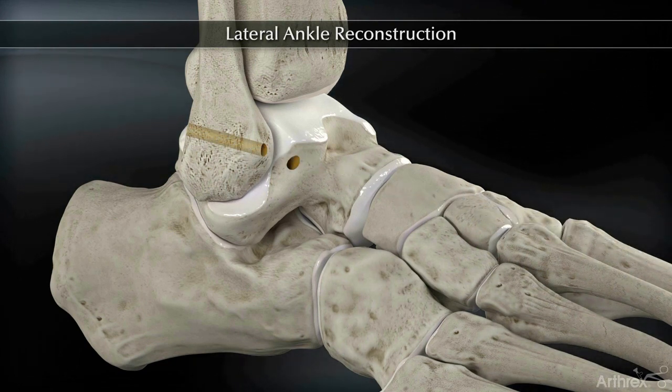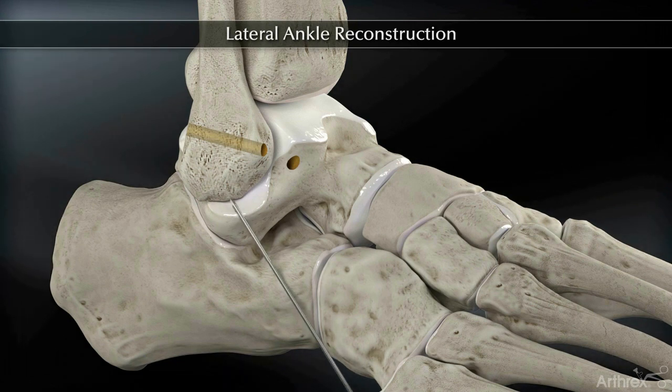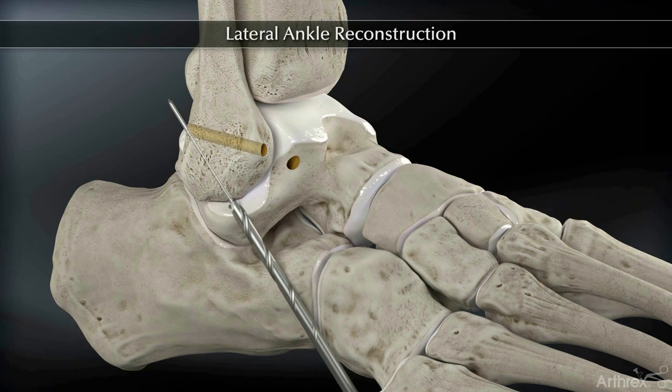The second fibular drill tunnel should be placed 5 mm proximal to the distal tip of the fibula. Insert the 2.4 mm tenodesis guide wire and drill over the wire with a 5 mm cannulated drill through both cortices in a similar fashion.